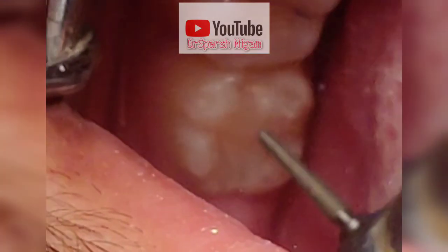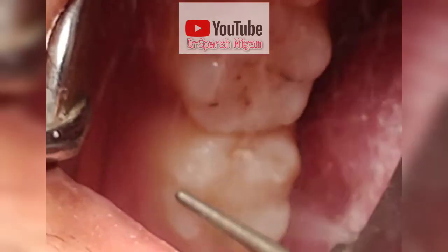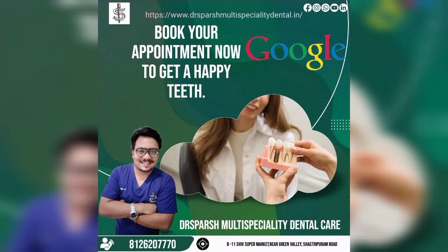Slowly, with the angles, I am cleaning all the margins and making it a round structure so that whenever the patient bites over it, they will not feel any obstruction on the tooth. Now the filling is finished. That was all from Dr. Spashnikam — keep watching and following us, thank you.